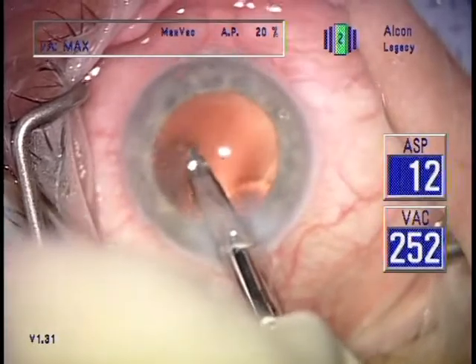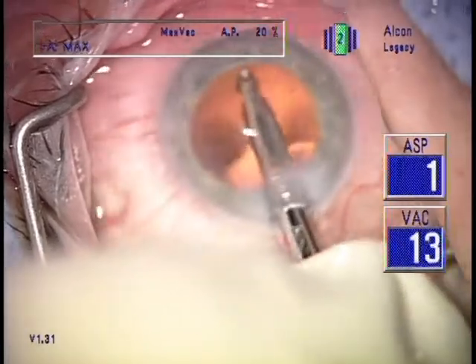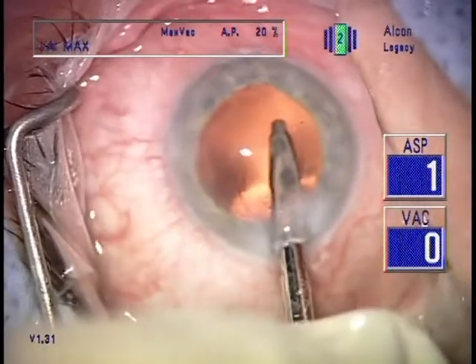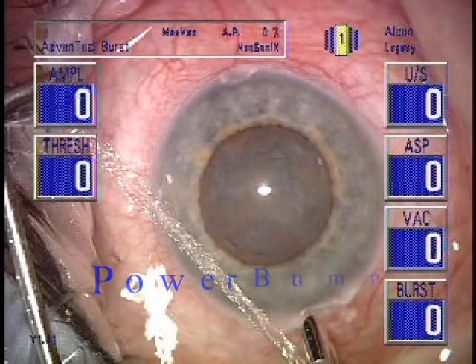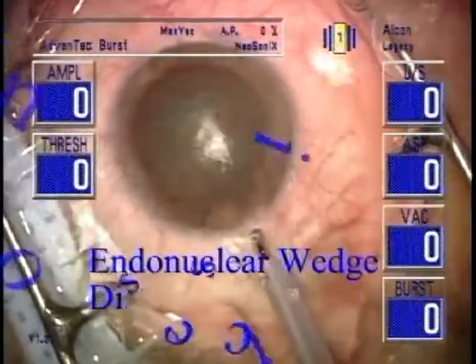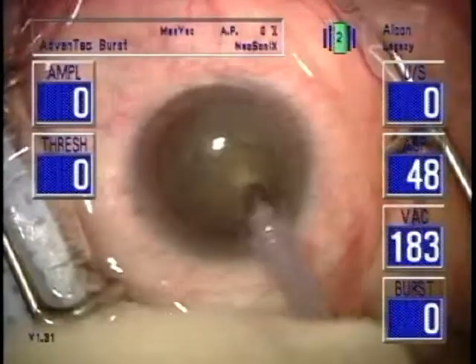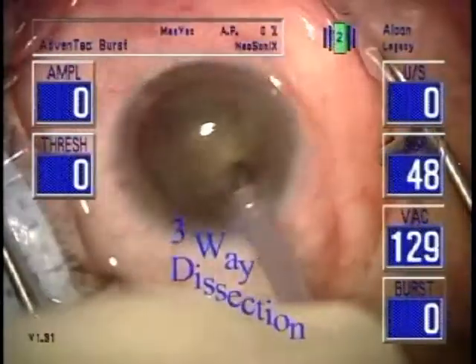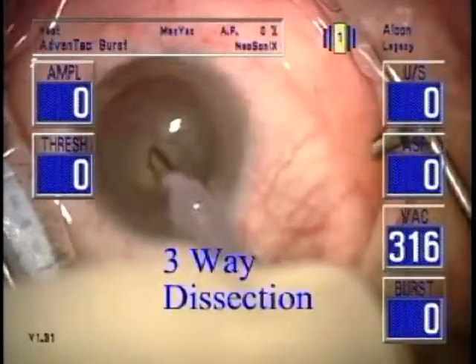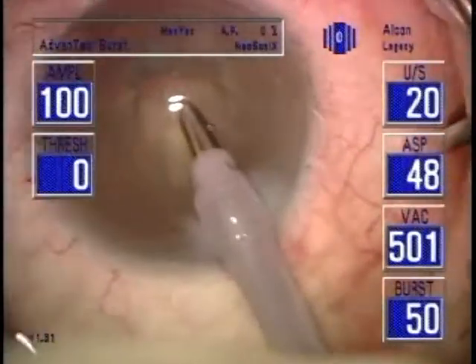A good occlusive probe that can lollipop has additional vice-like stabilizing qualities that will enhance cutting under high vacuum conditions. Power bump is an excellent technique to deliver a minimal amount of energy into the eye when vacuum cutting or vacuum aspiration needs to be supplemented. With endonuclear wedge dissection procedures, high vacuum technique is greatly facilitated by using highly retentive viscoelastics, namely Vitrax by Allergan or Viscoat by Alcon, with Vitrax being the most retentive. Filling the anterior chamber with a retentive viscoelastic is true to our grapefruit principle, stabilizing the endonucleus for cutting.